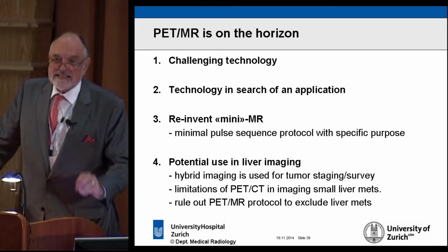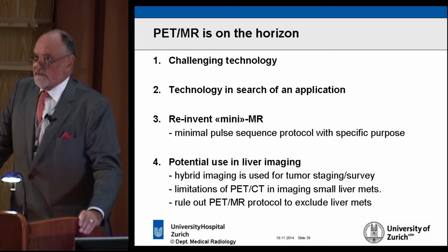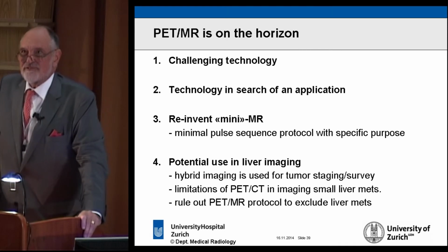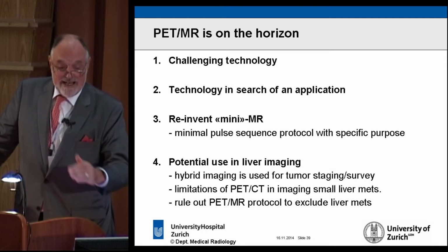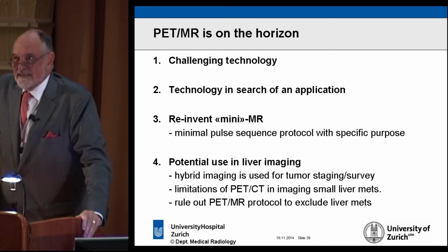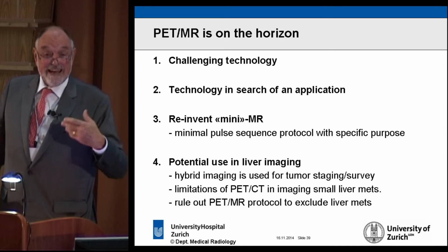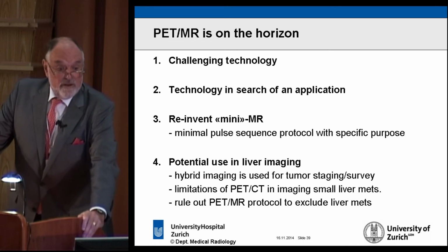I told you at the beginning it is a technology in search of applications, probably because PET-CT is doing so well. And so when you start to do comparative studies, where could PET-MR make a difference? This is not so obvious at this time point. There haven't been too many systems out and there are not too many studies out. And people also really don't know how to use MR properly in a PET-MR environment. So I think one is in the process right now to sort of reinvent MR. How do I have to run MR so that it fits well together with PET?